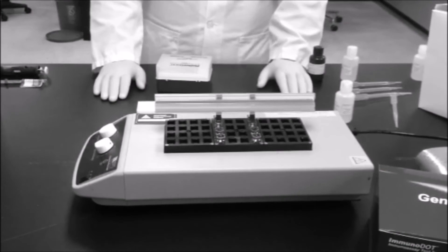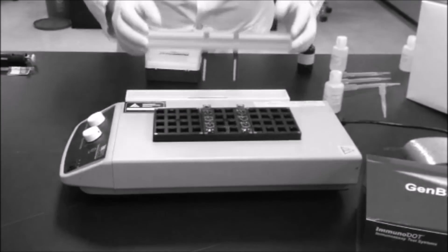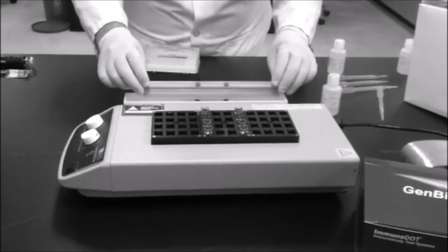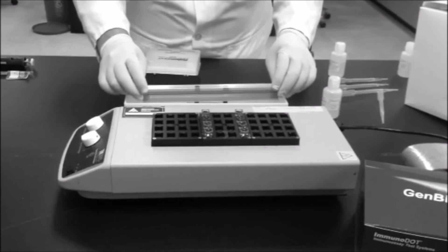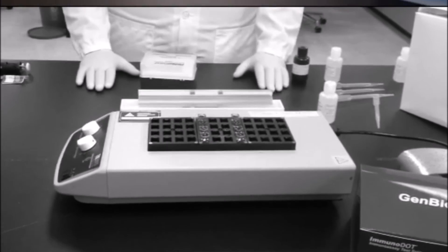After incubation in vessel number three, remove the assay strip and wash it by swishing it 5 to 10 seconds in the wash. And then, very importantly, allow the reaction strip to soak in the wash for 5 minutes.